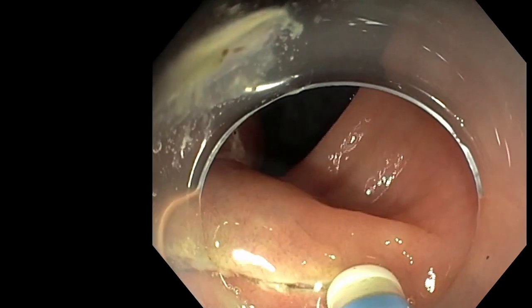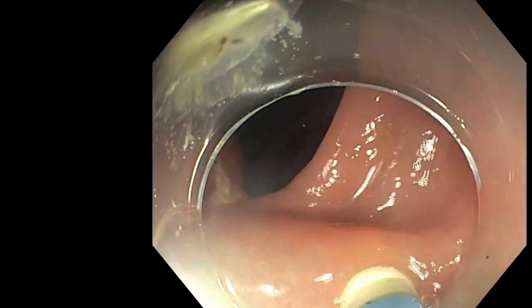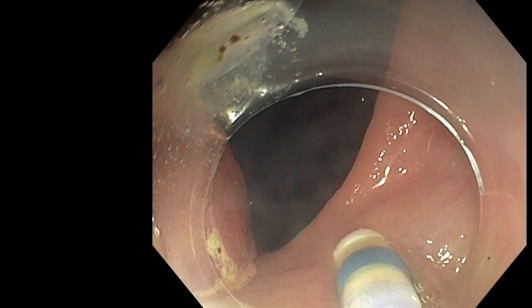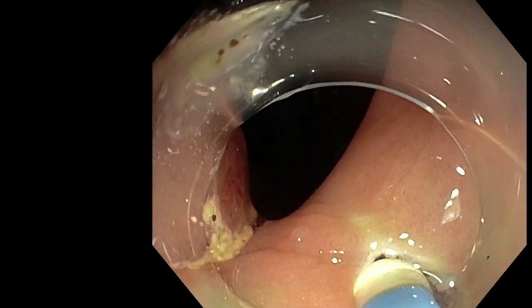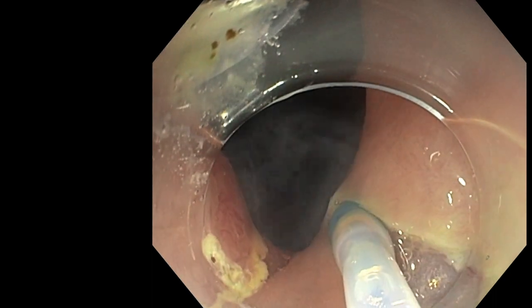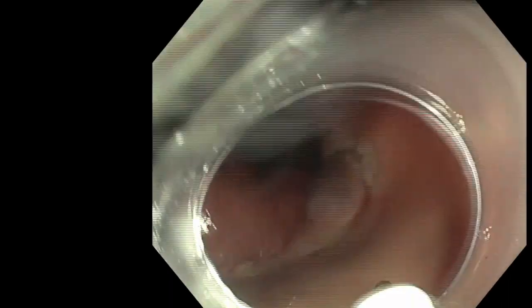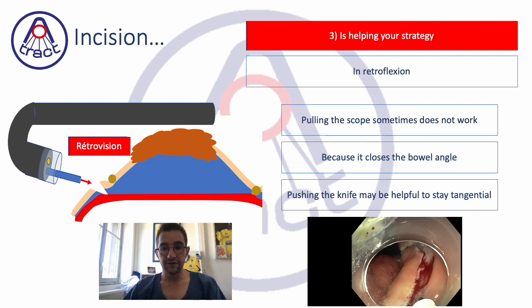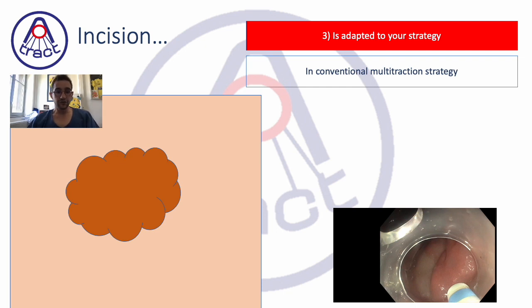Pushing the knife in this case will actually be effective. We inject and then try to slide — I cannot go there with my scope because when I advance I close the angle. We are at the recto-sigmoid junction, but it is possible to cut by advancing the knife deeply and sliding at the surface. I am tangential, so there is no risk of perforation. At least the second part of the fold is treated and I will be able to achieve the resection by coming back to direct viewing.